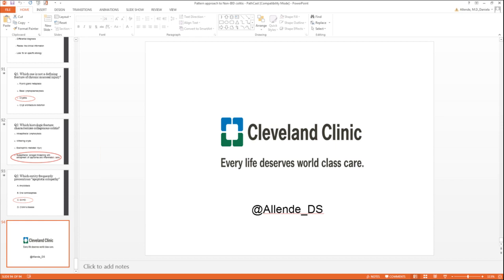As a general rule, I have to say, if I'm making the first time diagnosis of any patient with granulomas, I do order the AFB and GMS stains up front in any case, independently if I see necrosis or not in the granulomas, because many times you don't. The truth is most of the stains come back negative. The stains do have a low sensitivity. So if I'm concerned, because the patient is presenting in a particular way or has risk factors, I may highlight this to the clinician. We may pursue this on PCR.